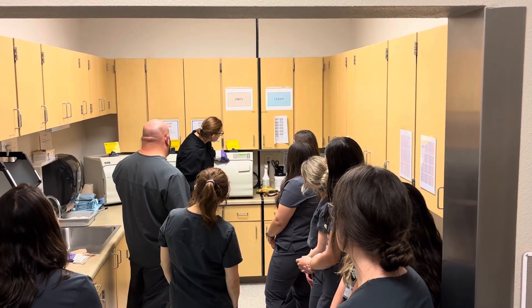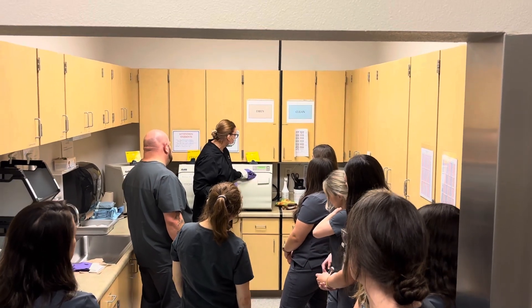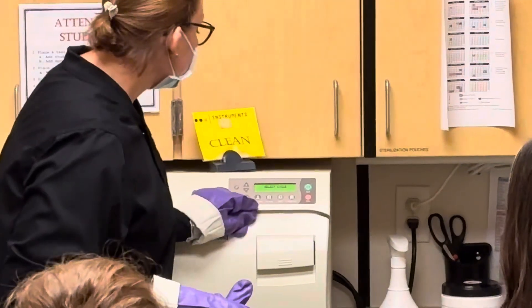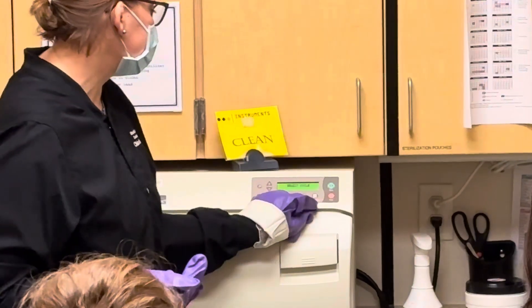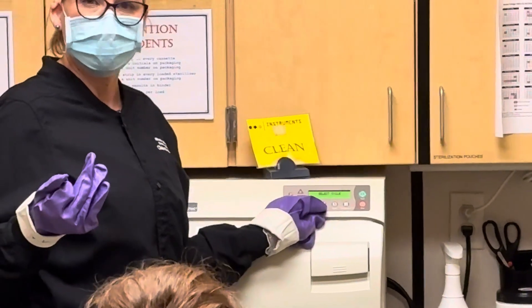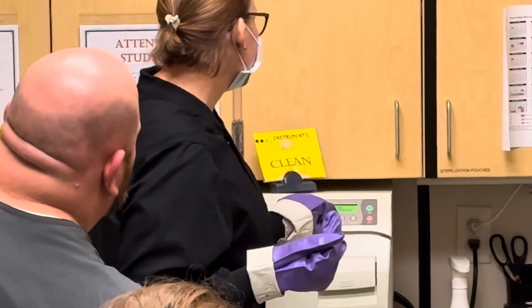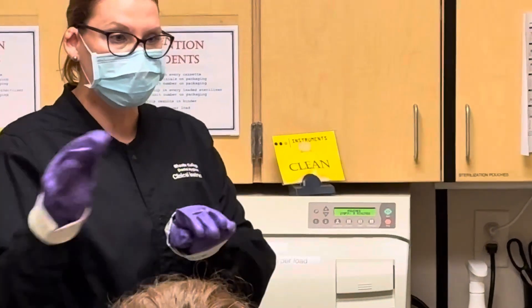And then you can see there's a lot of choices up here at the top for what we're going for — basically how we have our instruments done. There's unwrapped, pouches, packs, or handpieces. We're doing pouches. Packs is like if any of you have worked in an office and you're actually wrapping them.